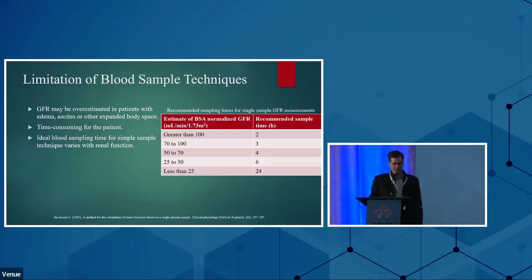The higher the GFR, the shorter is the recommended time after injection for maximum accuracy.